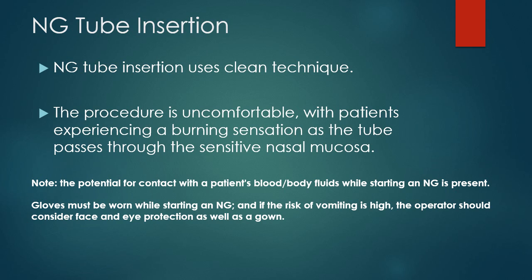The procedure is very uncomfortable, and patients experience a burning sensation as the tube passes through the sensitive nasal mucosa. And we can do a number of things to make it a little more comfortable for our patients. As well, once the tube is in place, it's still uncomfortable because you can just think of having a tube in your nose and sitting at the back of your throat, and how uncomfortable that would be. And again, we'll talk a little bit about how we can make this a little more comfortable for our patients.